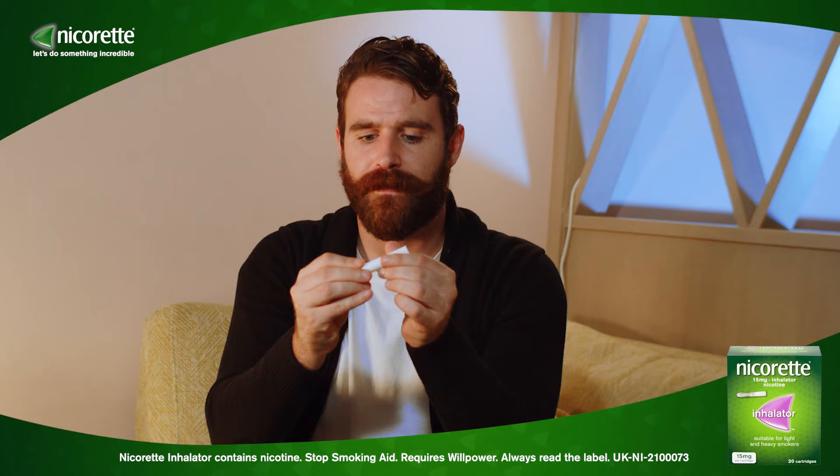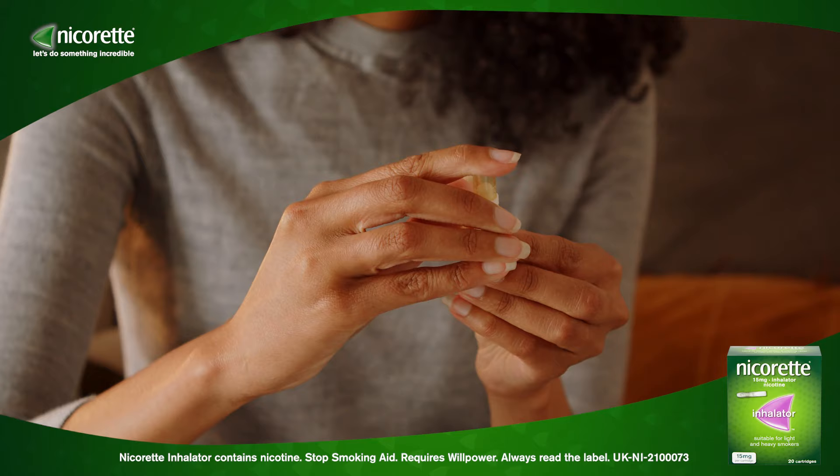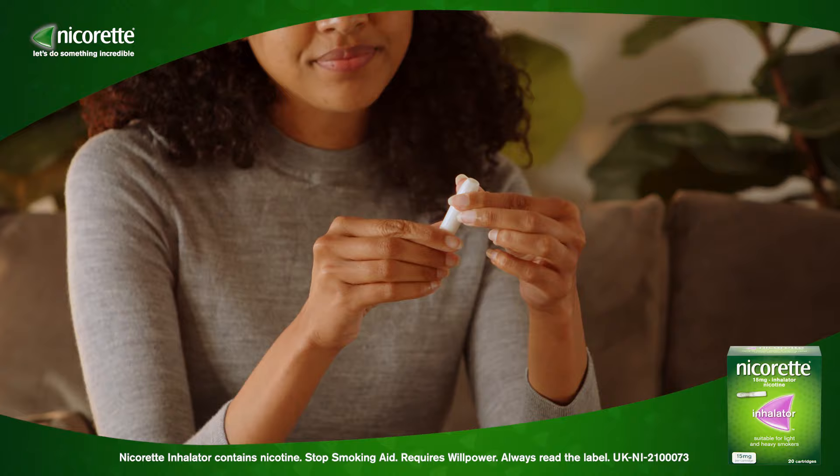Firmly push the cartridge into the bottom of the mouthpiece until the seal breaks. Then line up the two parts, push together firmly, and finally twist to lock.